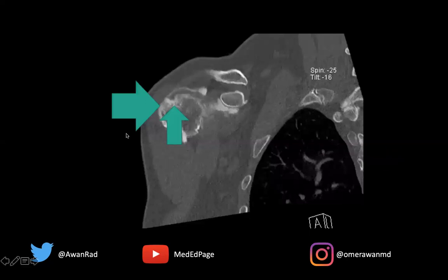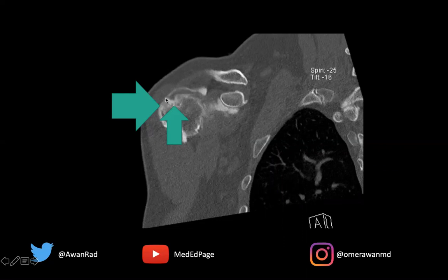This is another image in the study that shows the full thickness tear along the anterior fibers, where you can see contrast extending from the articular surface where the bone is, all the way to the bursal surface where the subacromial subdeltoid bursa is. This dense linear line is the contrast extending through the entire thickness of the rotator cuff — a nice example of a CT arthrogram demonstrating a full thickness rotator cuff tear.